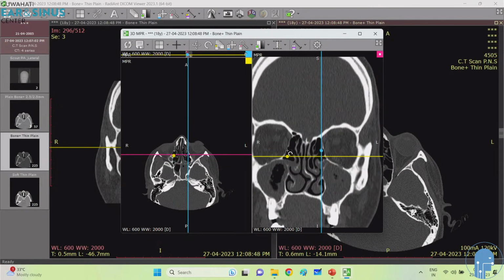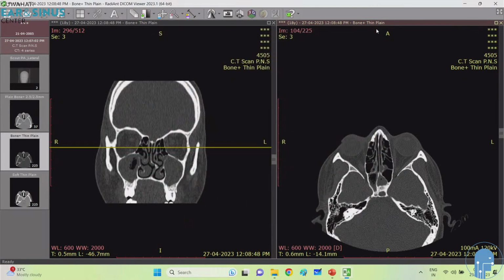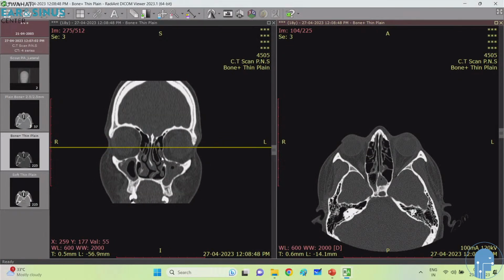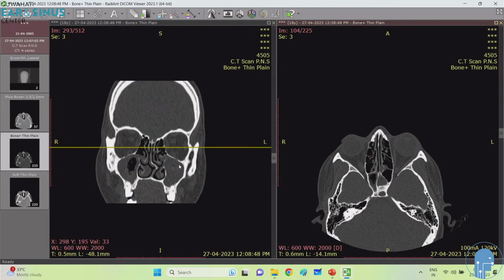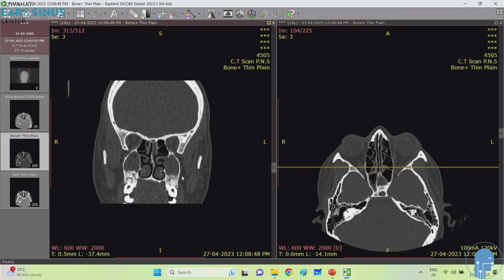The second point is the maxillary sinus, which is triangular in the anterior cuts, and when it goes to the posterior ethmoids, it becomes oval. The skull base in the anterior region is sloping and thinner, and the posterior skull base is thicker and flat.